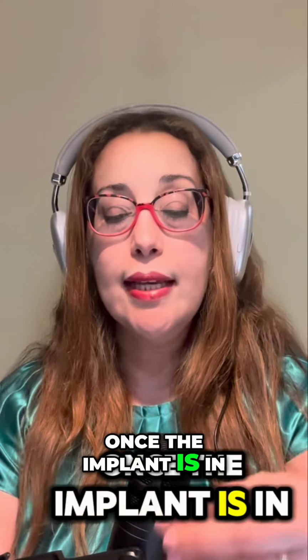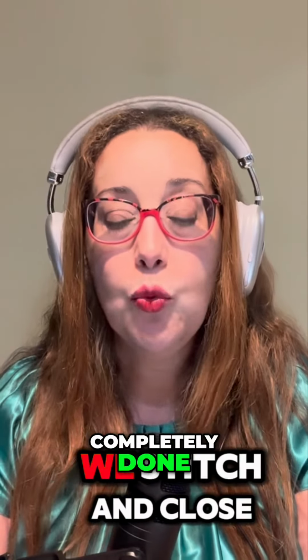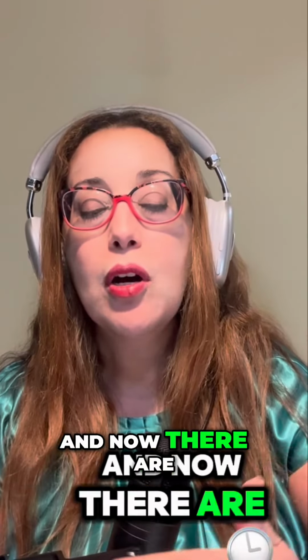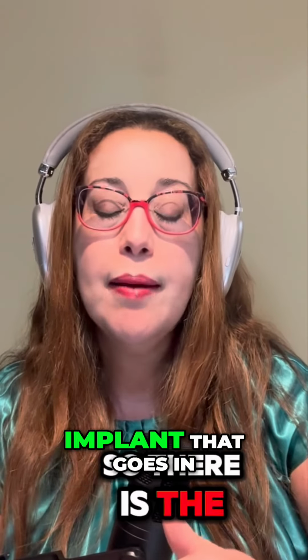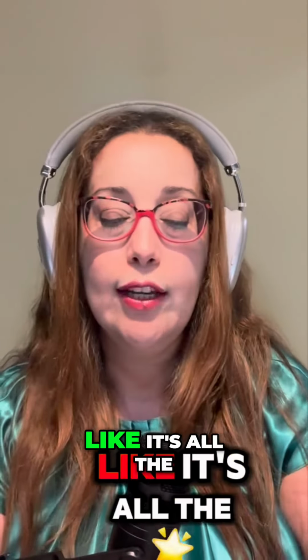So once the implant is in, before I even am completely done, we stitch and close. And now there are different kinds of implants. So there is the implant that goes in the bone, all the way down in the bone, which is called endosteal, like it's all the way in.